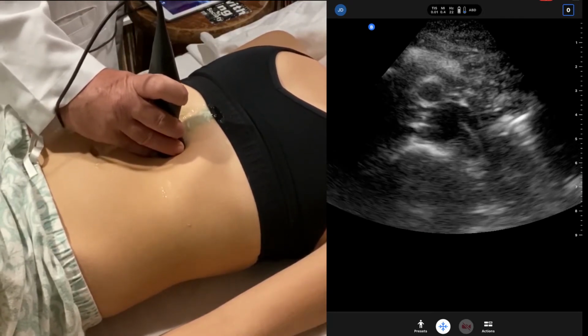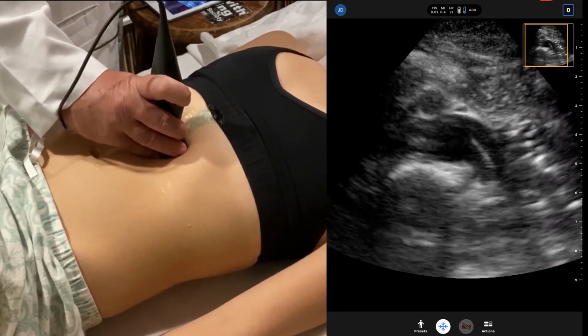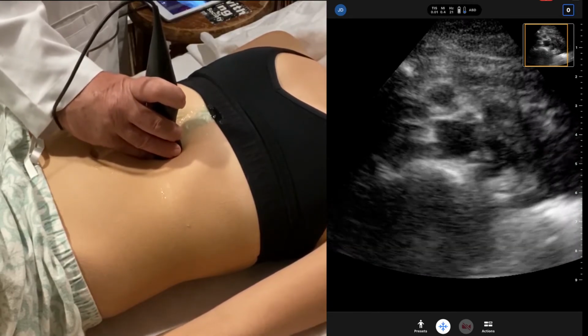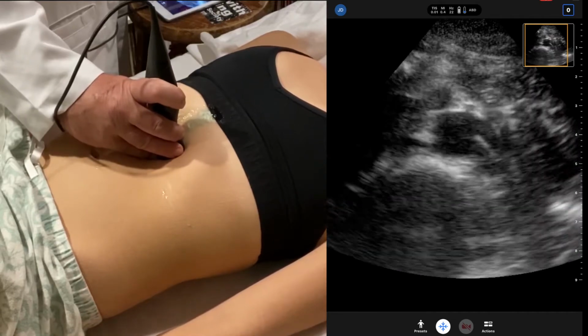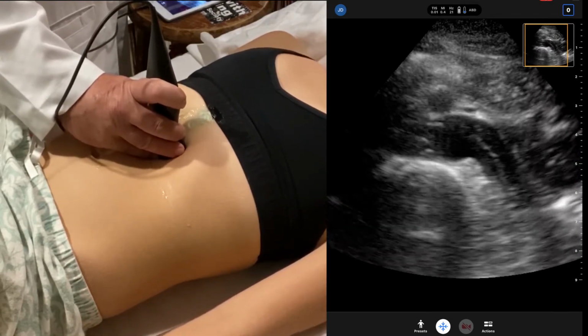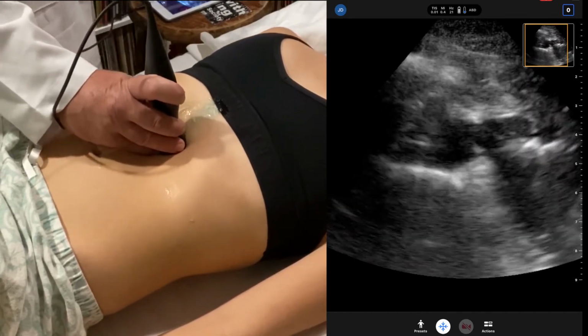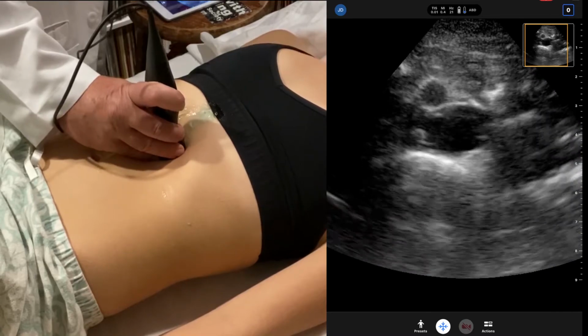You can decrease your depth, as what happens here, it becomes more superficial right around here. You must decrease your depth as now the aorta is much more superficial. It's about 5 centimeters. As we go more distal, the depth can become less. If you look at the scale to the right of your screen of the shot there, about 2 centimeters.